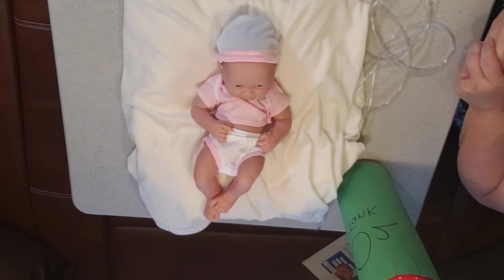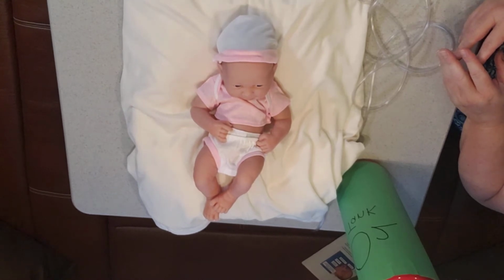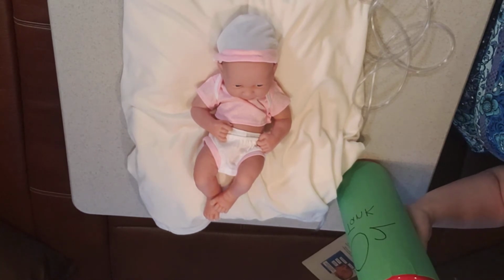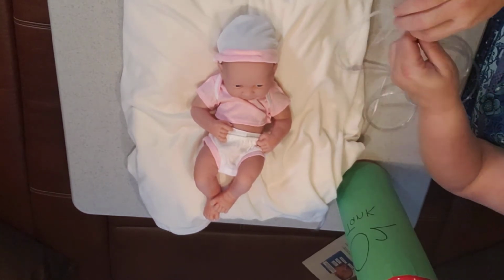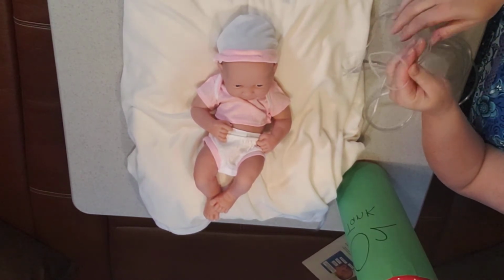Once the needle moves out of the green, it's time to contact my supplier and get more oxygen. Yes, that's great. Perfect. I couldn't have said it better myself. So you just want to make sure that you keep an eye on that needle and that it's not getting too low. Okay, so the next thing we're going to do is apply the nasal cannula to the baby doll. Bethany's going home on 1/2 liter of oxygen.